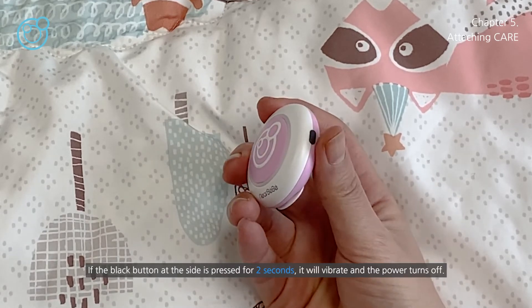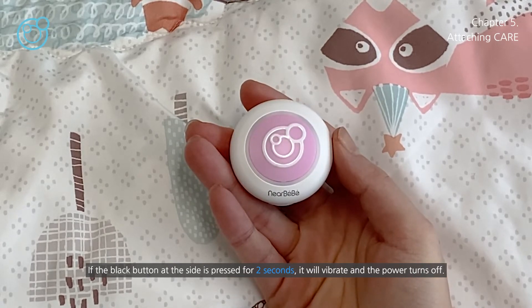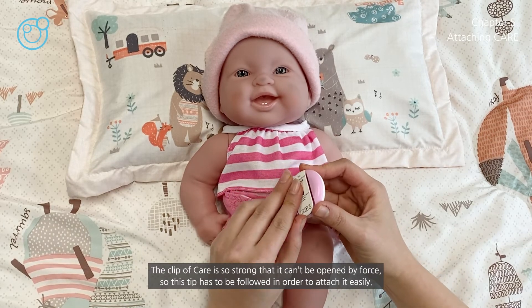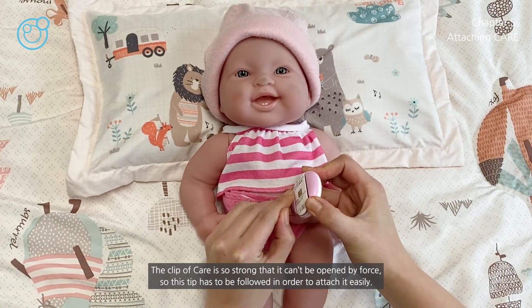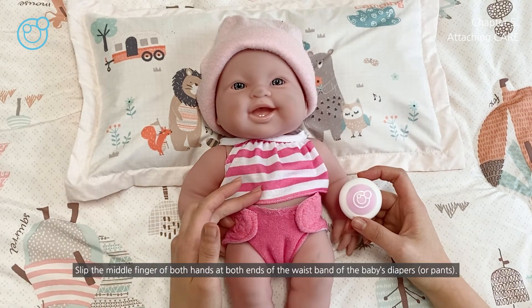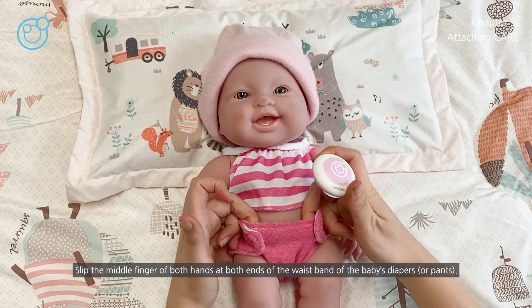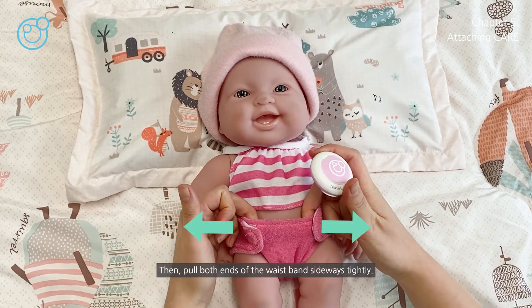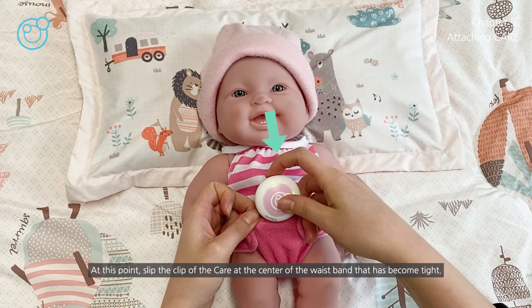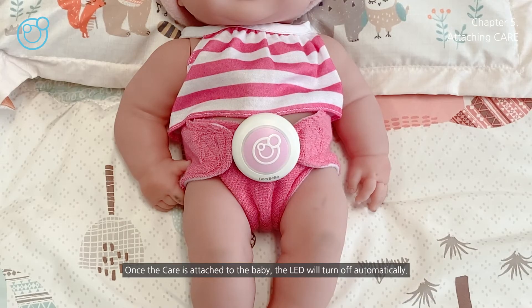If the black button at the side is pressed for two seconds, it will vibrate and the power turns off. Now we're going to attach care to the child. The clip of care is strong and can't be opened by force, so this tip has to be followed to attach it easily. Slip the middle finger of both hands at both ends of the waistband of the baby's diapers, then pull both ends of the waistband sideways tightly. Slip the clip of care at the center of the waistband that has become tight.